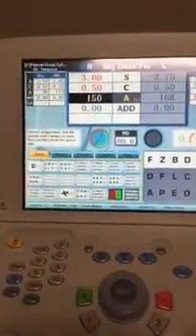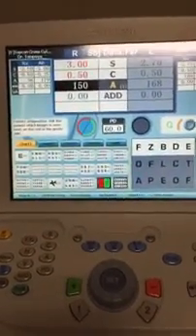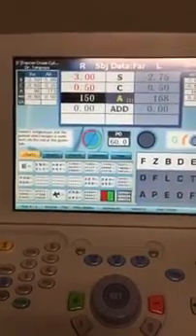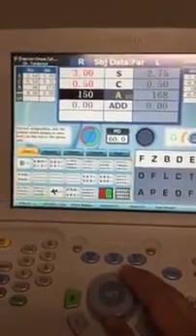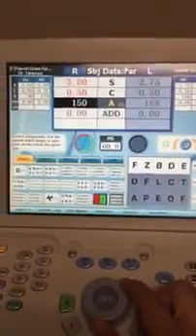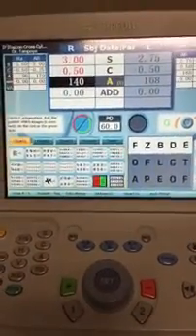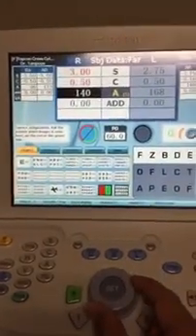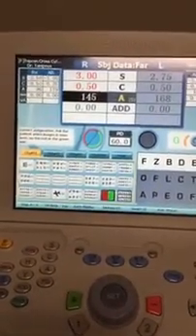Okay, now after I move the axis, let's say that the patient says that the red side is clear, and so since I want to refine things and narrow things down, I go from 15 degrees to 10 degrees and move it over 2 steps. But first, let me make sure it's on 5 degrees, not 1. Okay, and I say which one's clear, and now they say the green side, so I'll just do 1 step in the green side and stop right there, just to narrow it down some more.